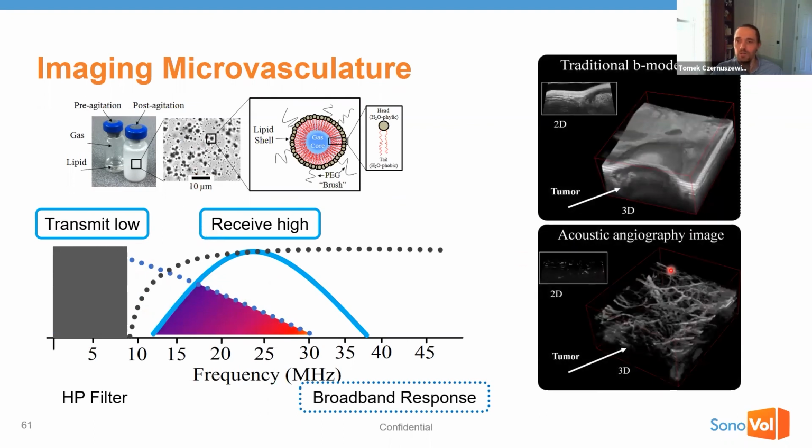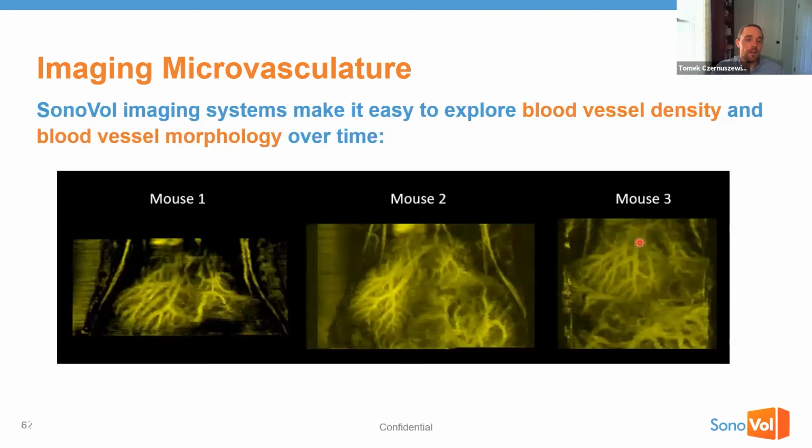And the microbubbles are limited to where they can go. They can only stay in the vasculature. Therefore, we can create these maps that essentially show us what is happening with the microvasculature of the tissue, which the B mode cannot show us. To date we haven't done a fully fleshed out longitudinal study, as I've done with the echogenicity B mode and SWEI imaging modes, but we have taken some pilot data in livers and are observing really nice trends here that I think will translate when we do the longitudinal studies.